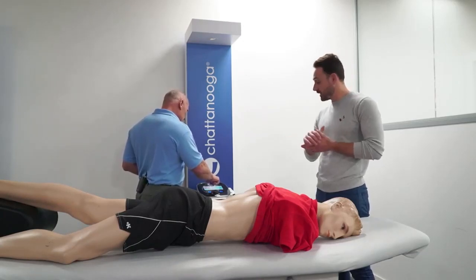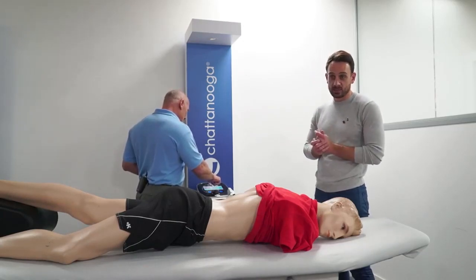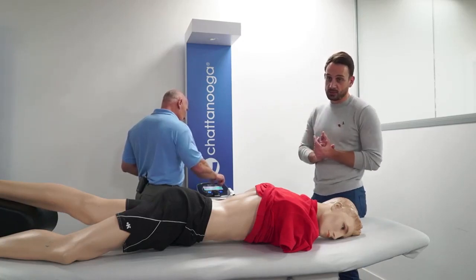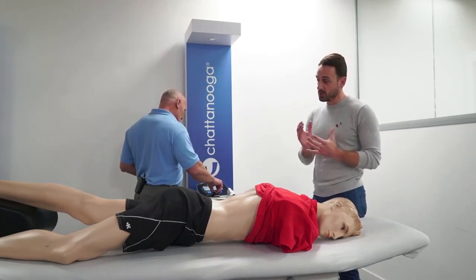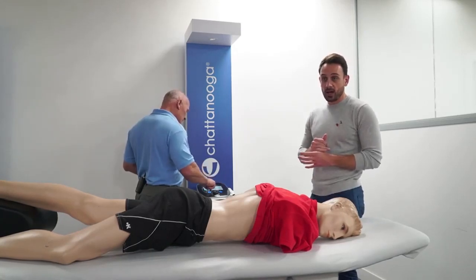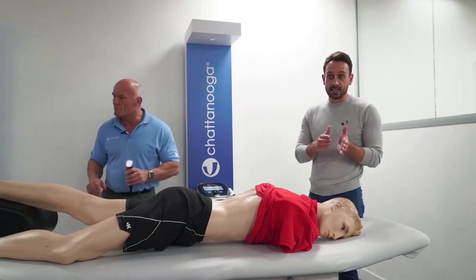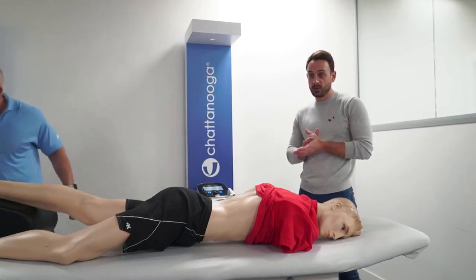The treatment time for the one study that I picked out here was a 12-minute treatment session. They're looking at acute presentations. They were recommending that you treat either daily or 3 times per week minimum. And for the chronic ones, you treat them less often, maybe twice a week.